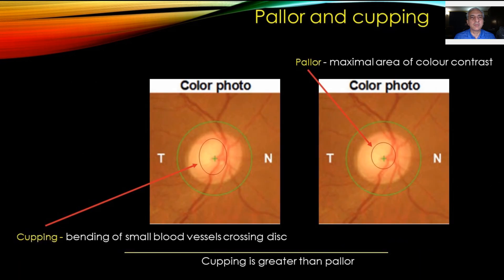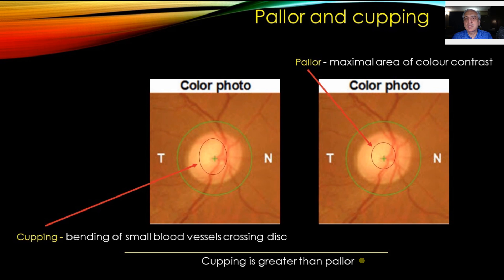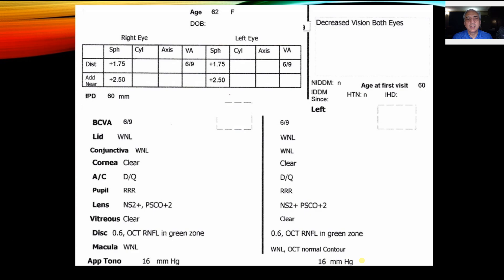Before we start, we need to differentiate pallor and cupping. Cupping is the bending of small vessels crossing the disc — here you can see the area where they are actually bending — compared to pallor, which is the maximal area of color contrast. Cupping is greater than pallor in this patient. Cupping is measured from where the vessels are bending rather than the area of pallor. That's a very important understanding of glaucoma.